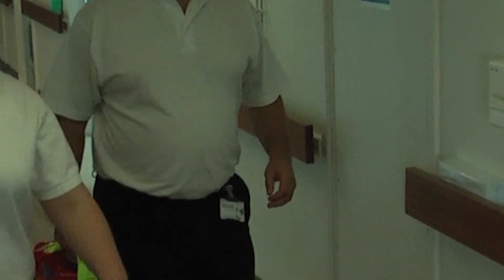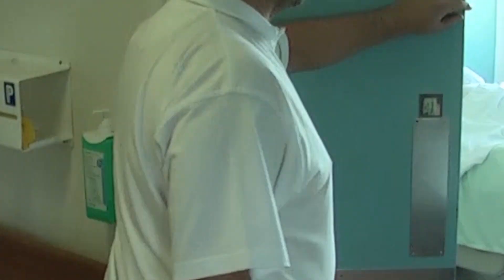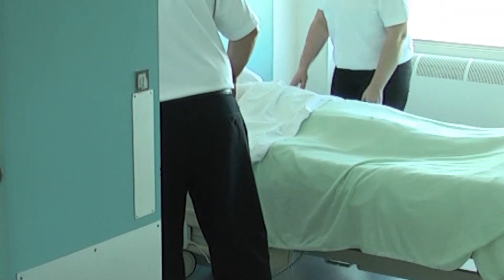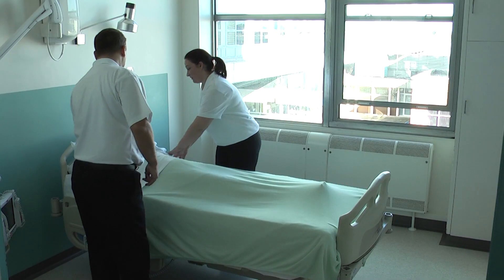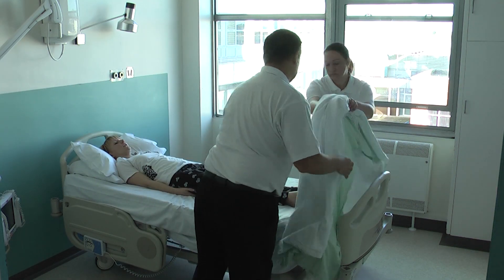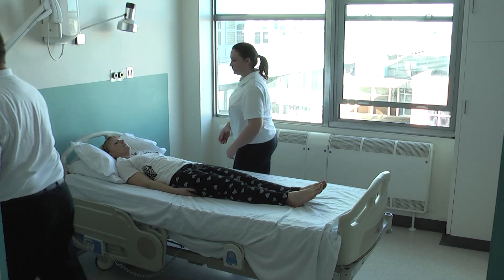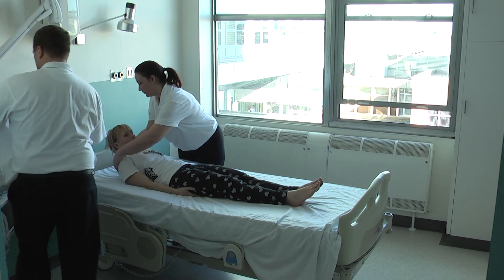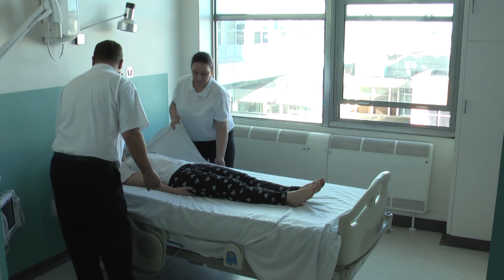When required in an emergency, the ALBAC mat can be carried to the user. If time allows, always work with the bed at a comfortable height. To prepare the user for evacuation, remove their pillows and the top covers and place to one side ready for later use.